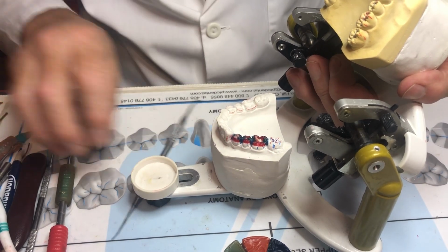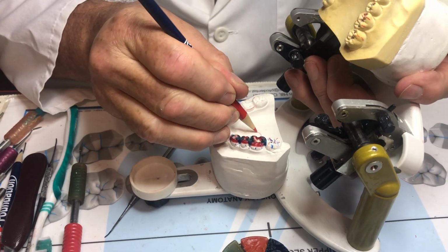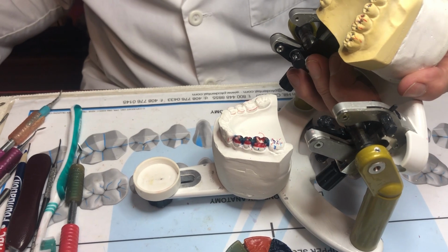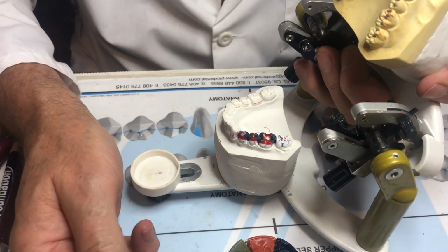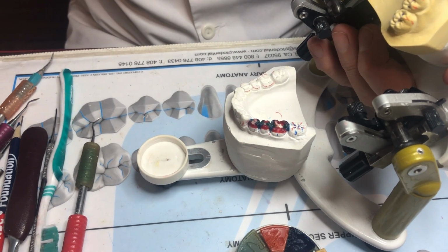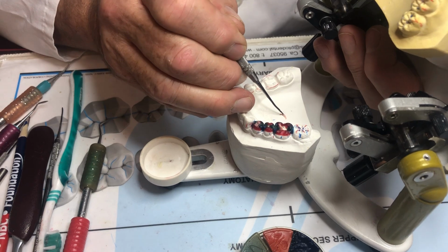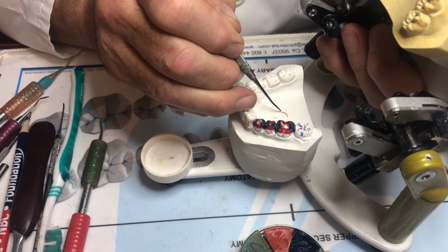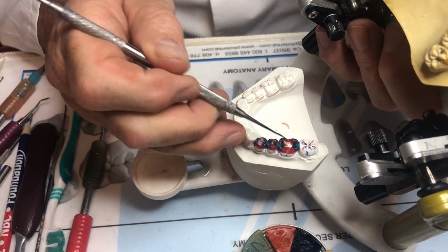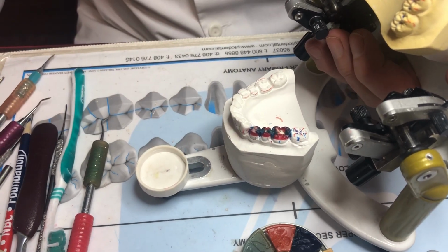If you're not sure, you can take a pen, make a little curve, if that's what it's going to look like. Take some wax, make believe you're carving it or waxing it, and you can actually come in here and make a curve. If you can make a curve here, then you can do it there. If you can't do it here, you're not going to be able to do it on your wax up either.